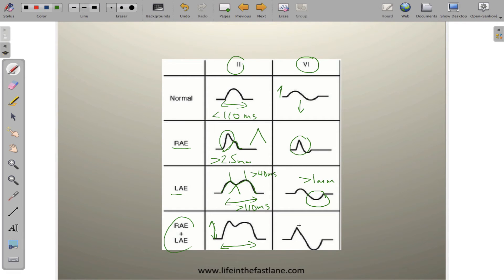With biatrial enlargement, you also see amplitude and shape changes of the P-wave in V1, and a terminal depth that exceeds 1 millimeter in lead V1. This chart nicely summarizes all of the changes associated with atrial enlargement.